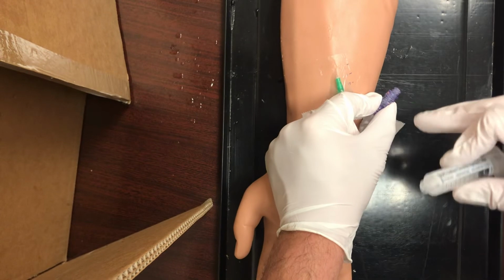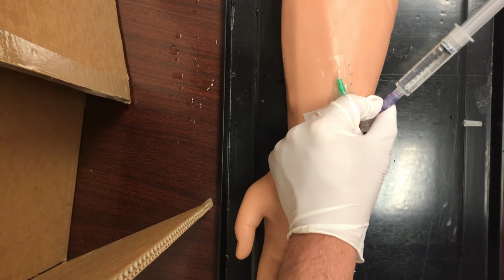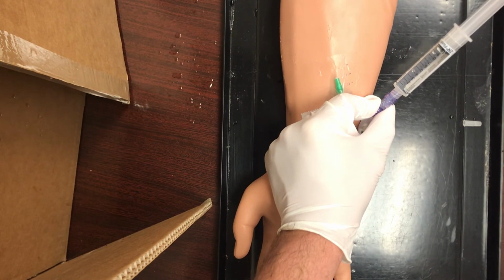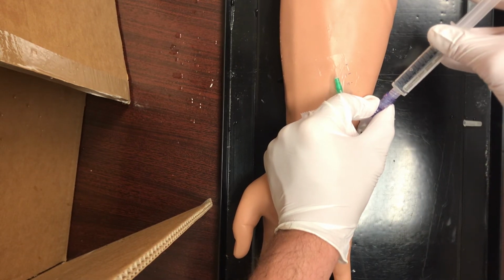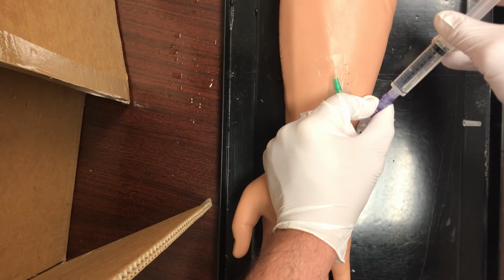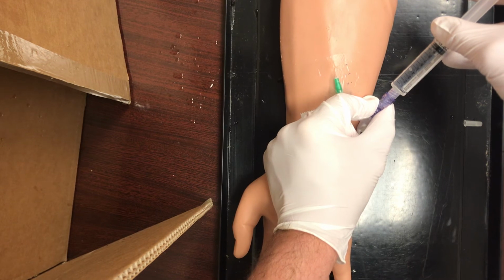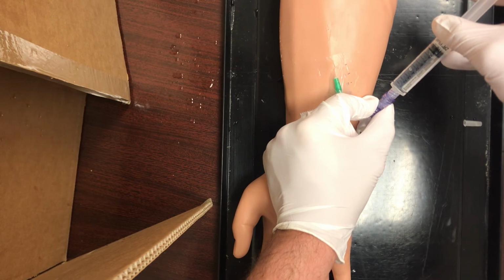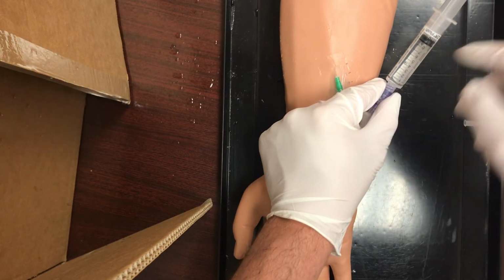This is still clean since we haven't contaminated it. We're going to reattach our syringe. And then this first ml, we're going to give over, let me see here. I don't think that's right. We want to give that first ml at the same rate. So we're going to give half an ml over 15 seconds. And double check my time there. At the same rate. Now, what we're going to do is push the rest of this in.